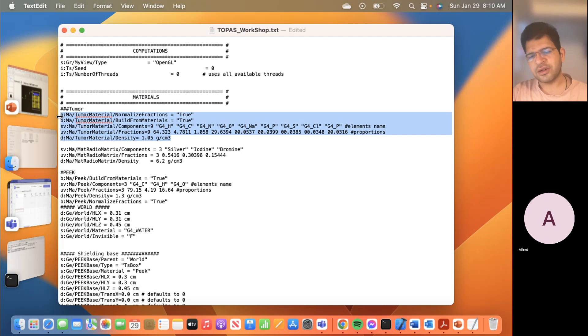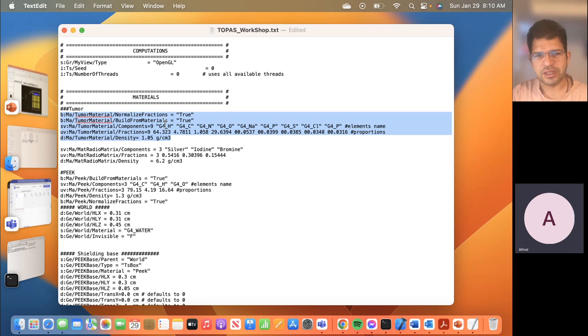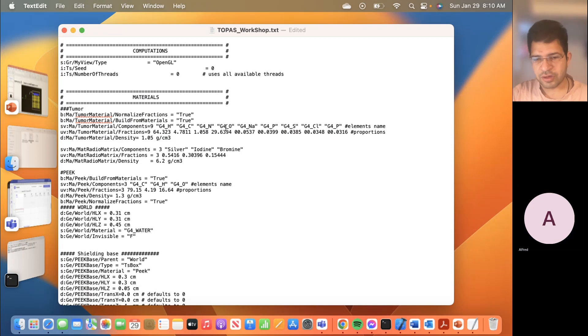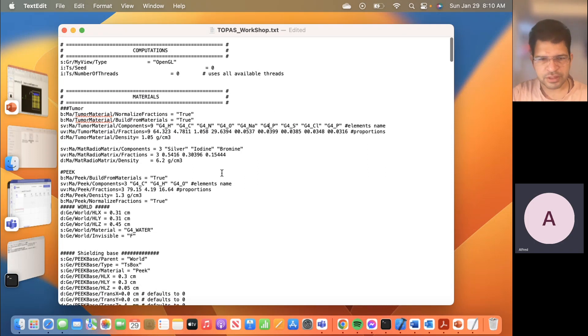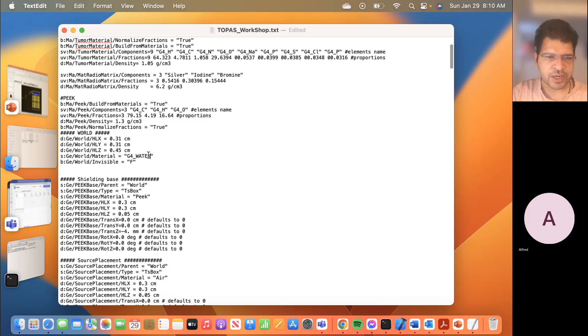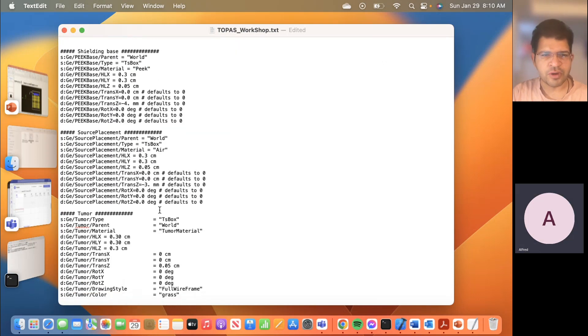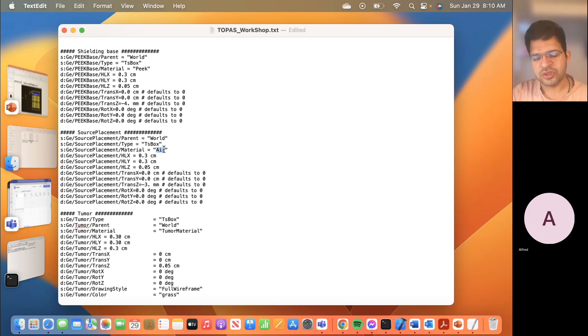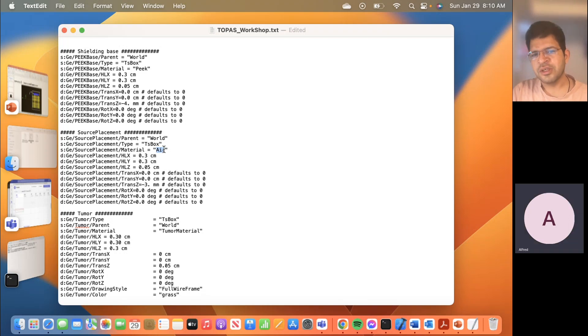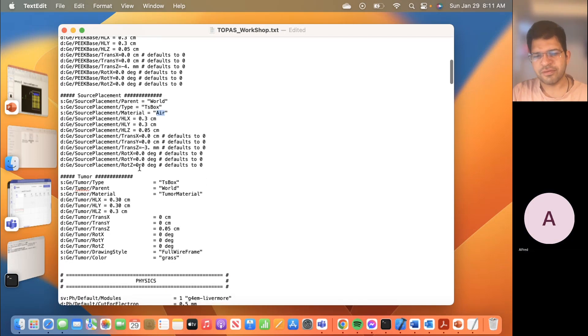Otherwise, there are some basic materials which are taken from Geant4, so you can directly use them. Like for instance, here's hydrogen, carbon, nitrogen, oxygen, sodium, potassium, phosphorus. And even you can directly use materials like water or air. These you don't need to define. They are already defined in TOPAS and in Geant4. Like I showed you in the last video, there are data files that we downloaded when we installed TOPAS. These data files already contain information about these materials.